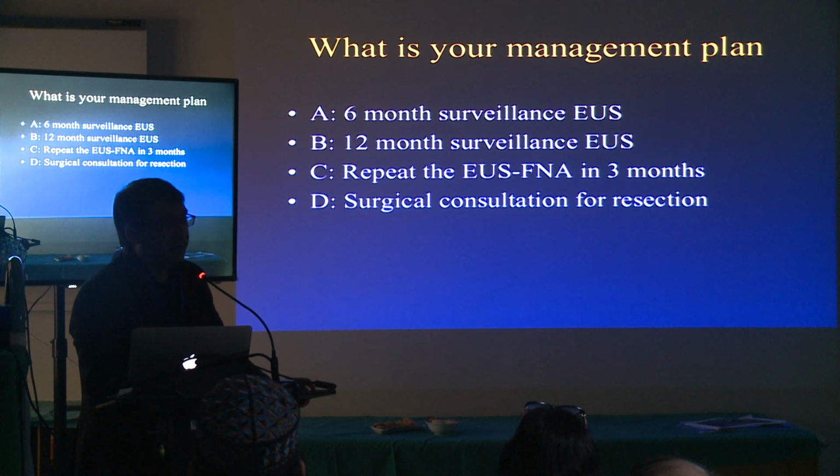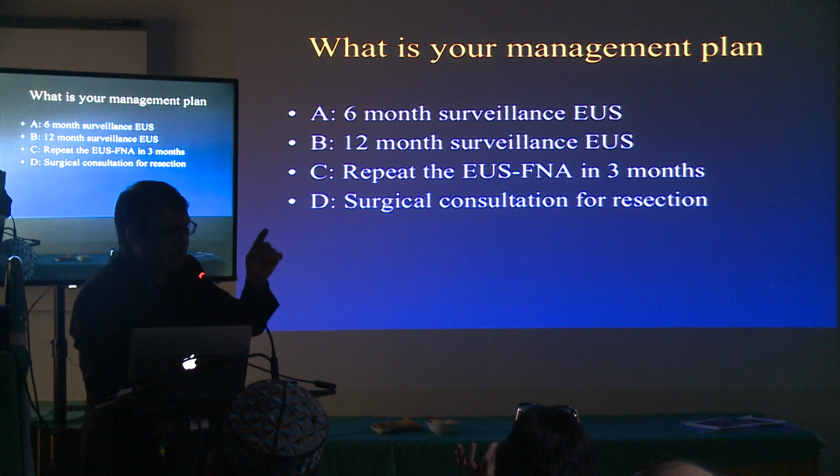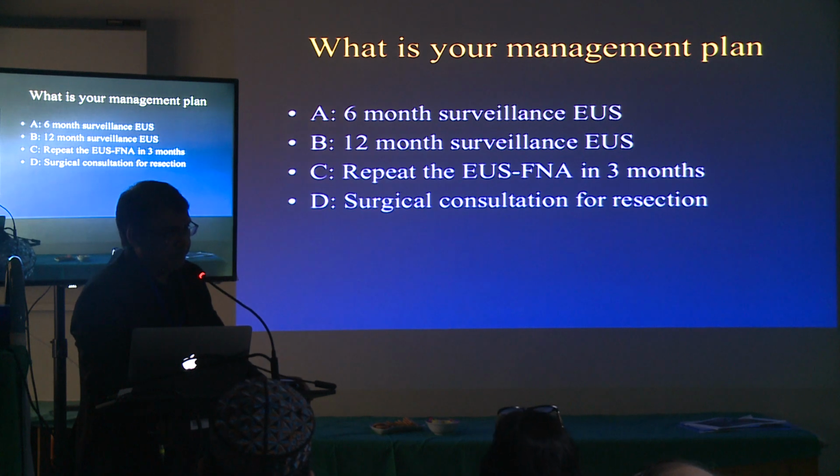Surveillance in how much time? 6 months, 12 months? 3 months, okay. Anybody else? No, we talked about that. That's a duct and there is a solid tissue around that. Okay, that could be IPMN. Okay, okay. So 3 months.